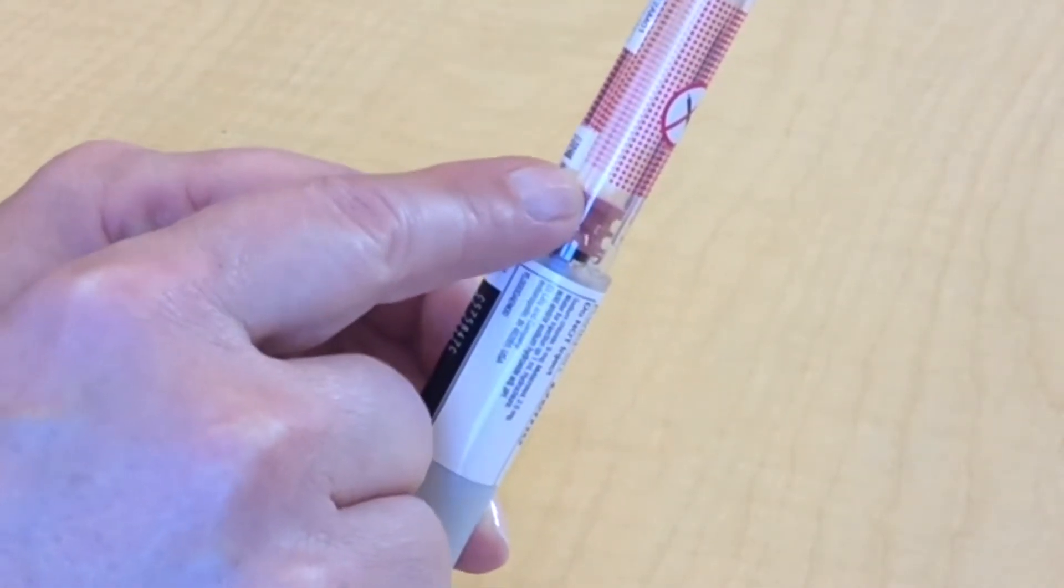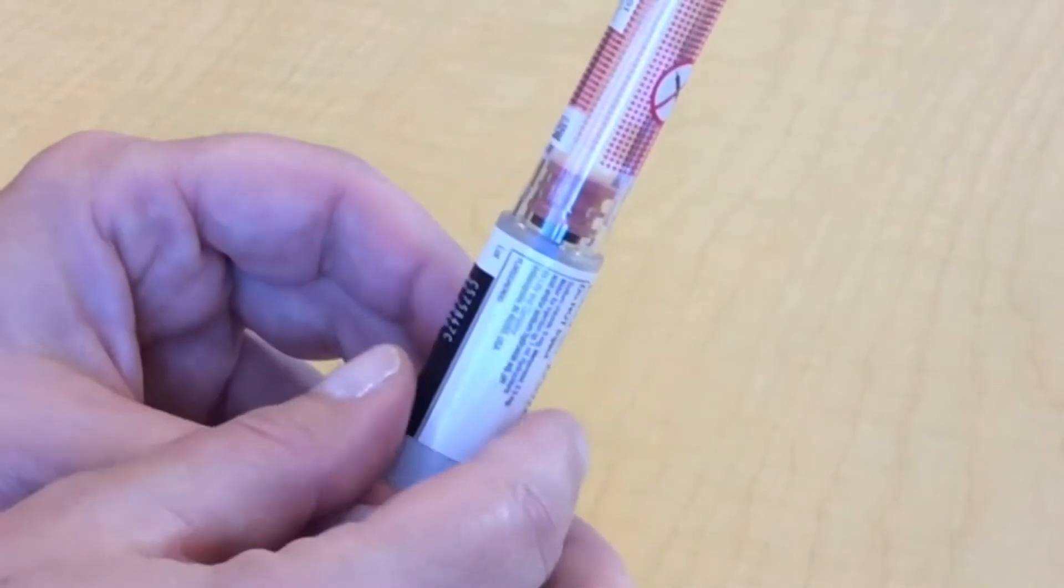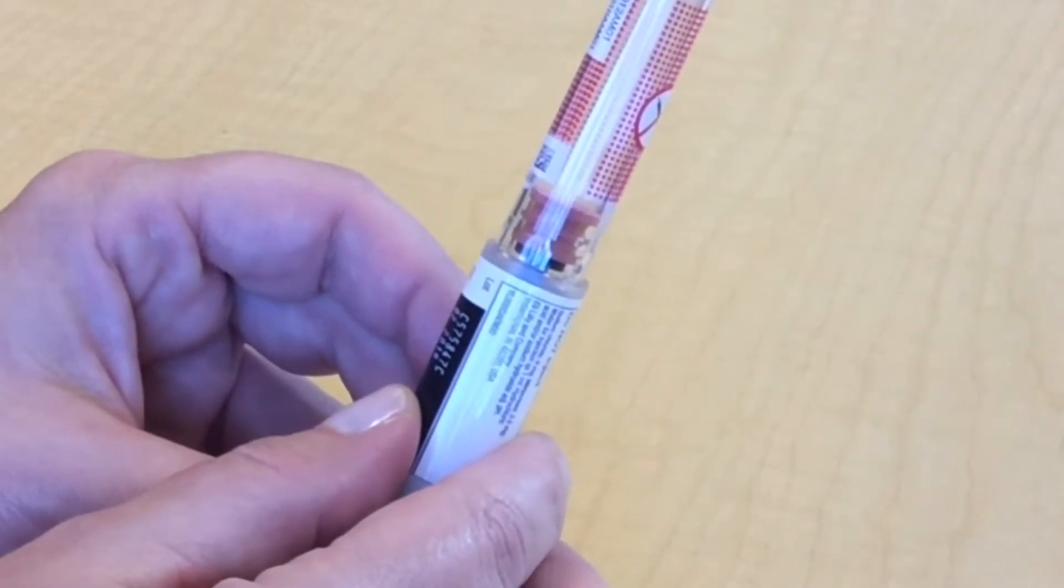If the insulin has changed color or if you see anything floating, it's not safe to use. Throw it out and get a new insulin pen.